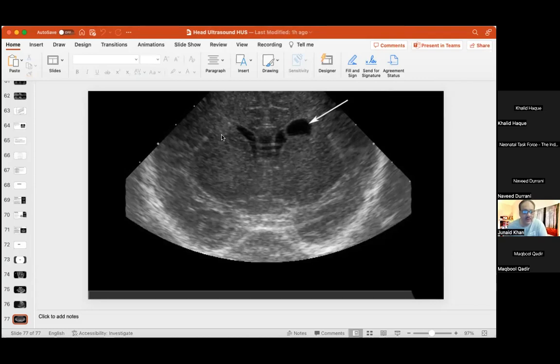Yes. One more question before we close today's session. Naveed, this is excellent that we go through it, but you know that we don't want everybody to get the probe and start doing the ultrasound and comment on that. So please comment on what the minimum requirement is before somebody starts doing the ultrasound of the head as a neonatologist, not the radiologist. Yeah, that's very important.